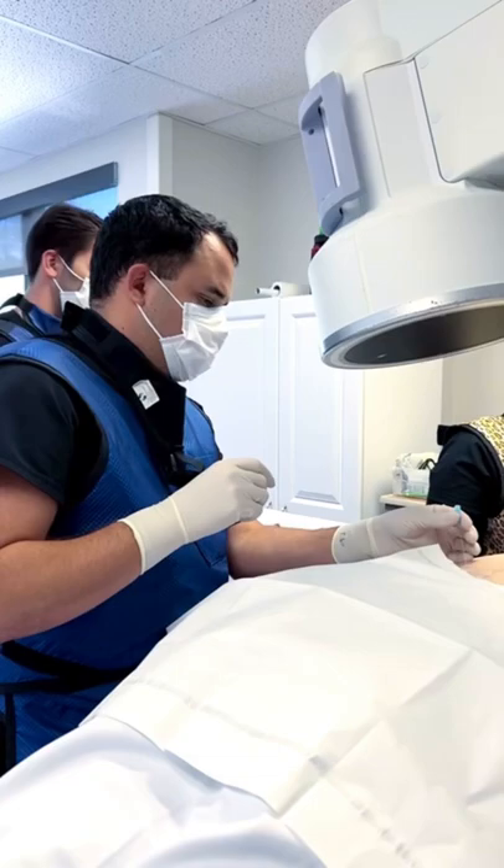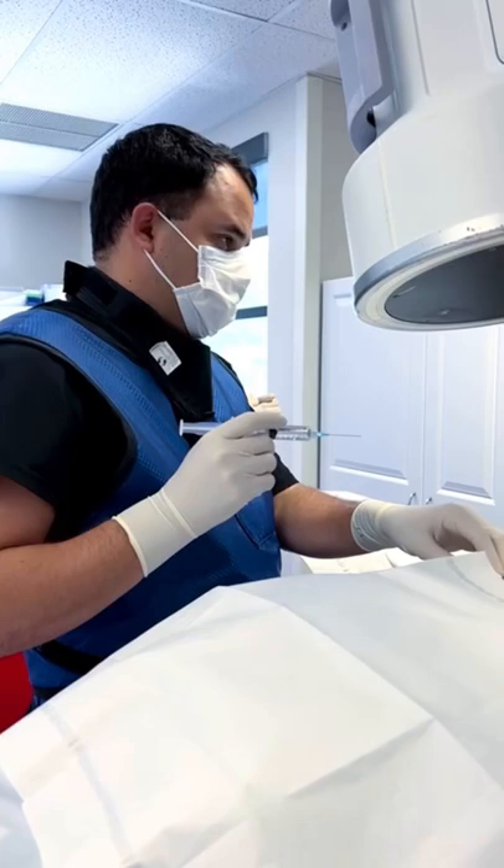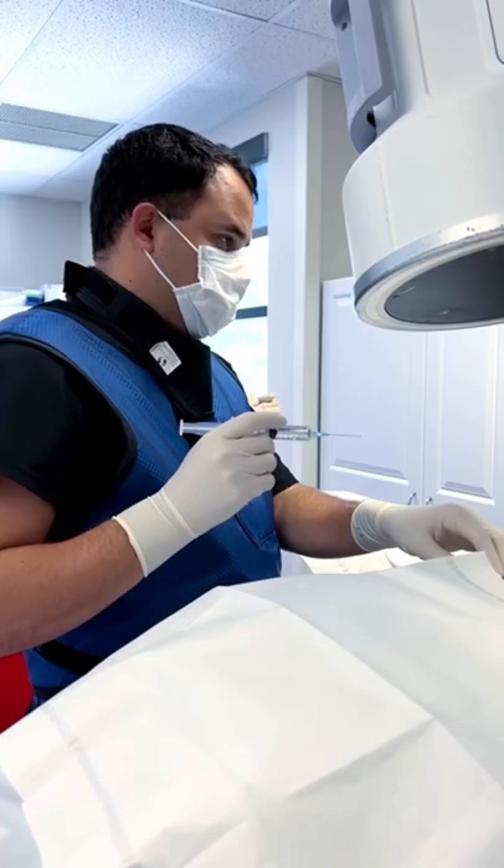As you can see in this video, I'm making a lot of small movements and every time I look up, I'm looking at the x-ray machine to make sure the needle's in the exact location I want it to be. I'm trying to get right in that location of the medial branch and put some medicine around there.